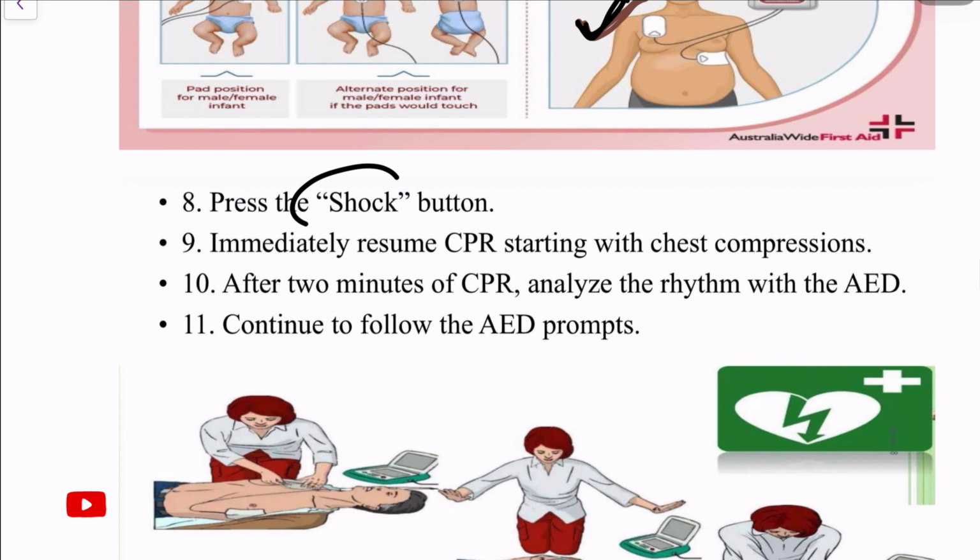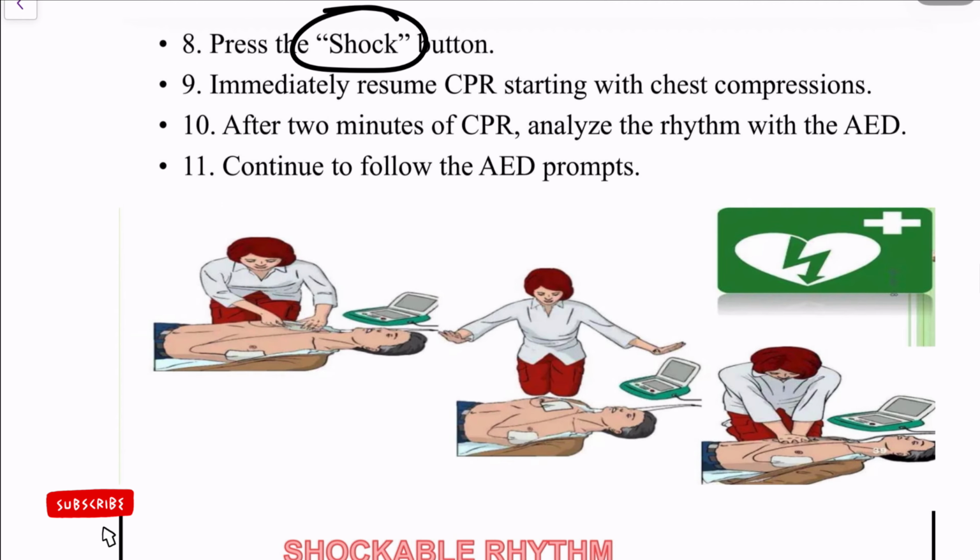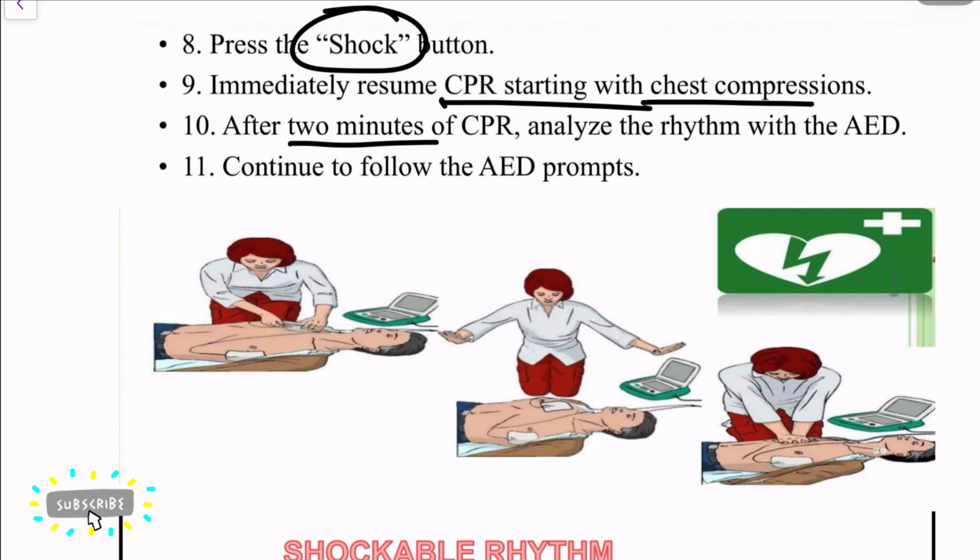Now press the shock button if it suggests the rhythm is shockable. Immediately resume the CPR starting with chest compressions, and after 2 minutes of CPR, analyze the rhythm with the AED. Continue following the AED prompts as the AED suggests.